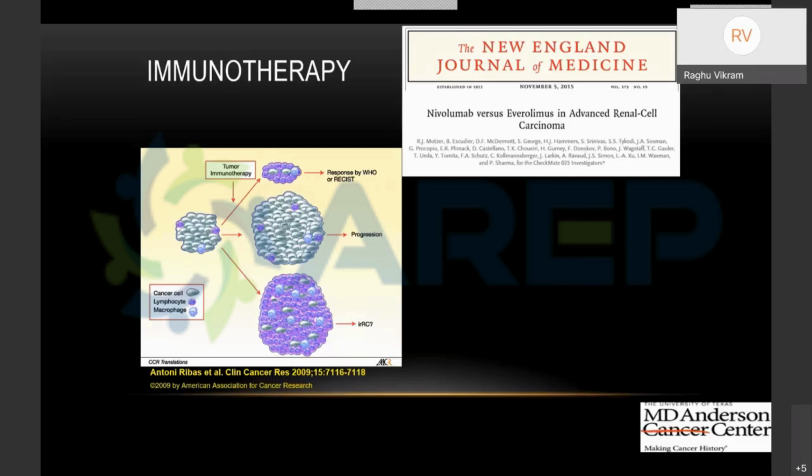No problem. My pleasure. If you have any other questions, please. Yeah, I have a question for you from our attendees. Sometimes papillary carcinoma looks just like a cyst, and when the lesions are too small, it is very difficult to measure the density. So is it just safe to follow up with imaging, or can we just ignore it if it's too small?